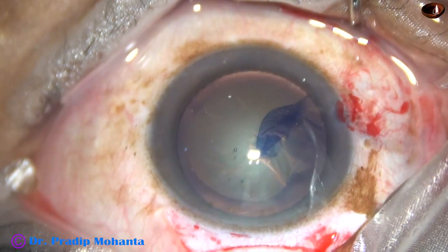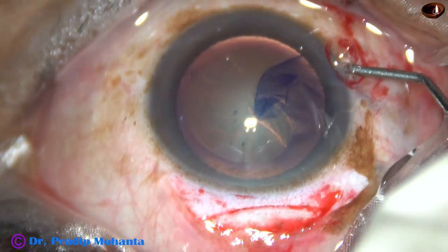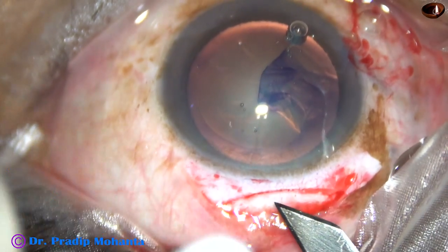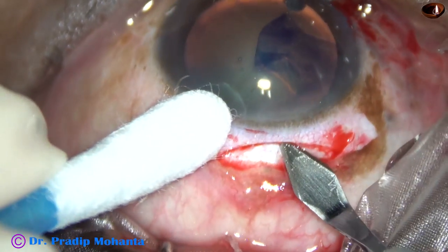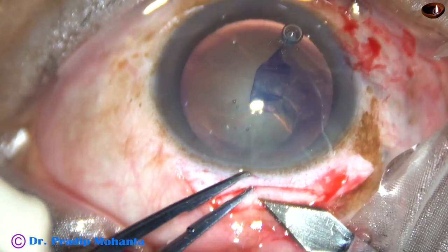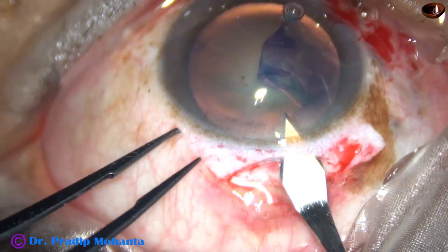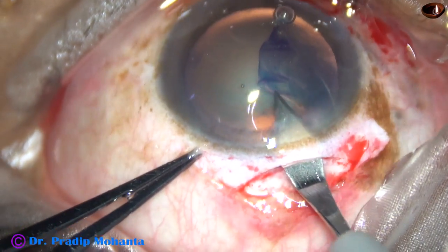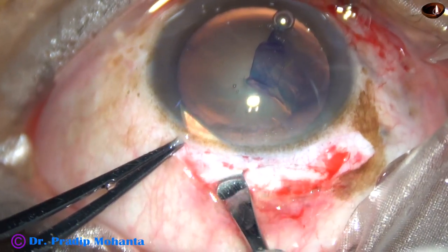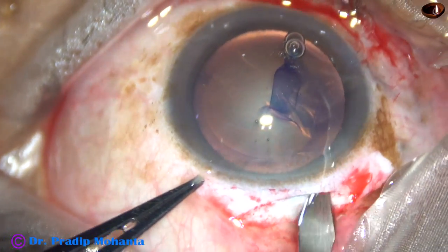This is a real-time surgery and you are watching each and every step. Now see how to open the tunnel: take a tooth forceps, hold the anterior leaf, go to the anterior extreme of the tunnel, and then go downward. Cut when you go forward — this is very important: cut when you go forward.